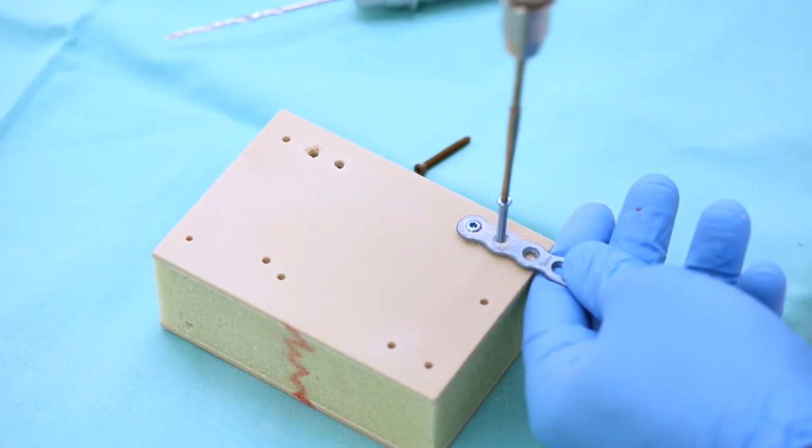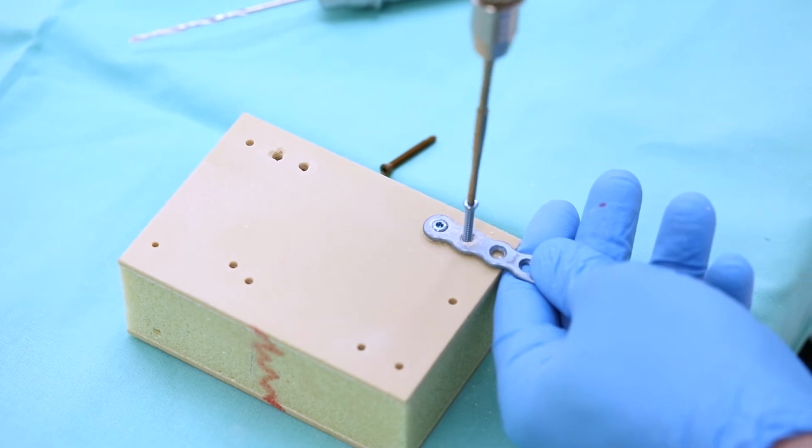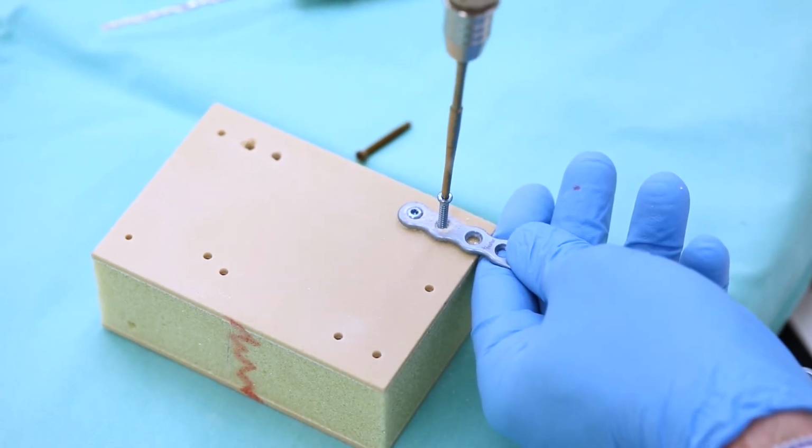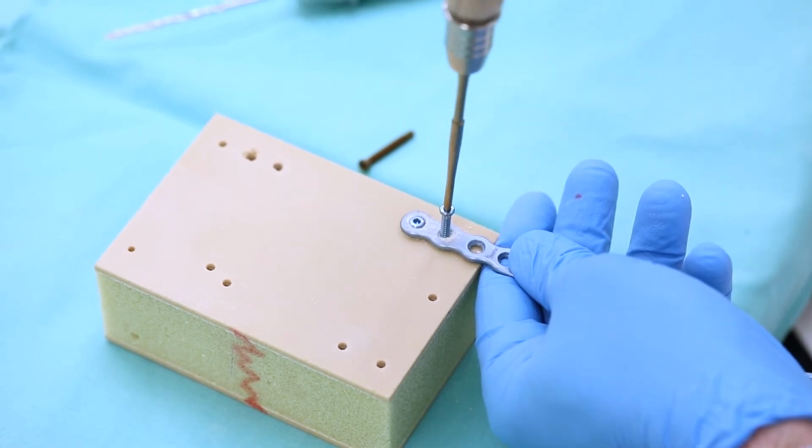The plate is now fixed with a conventional screw to the bone, but the screw is not fixed with the plate.